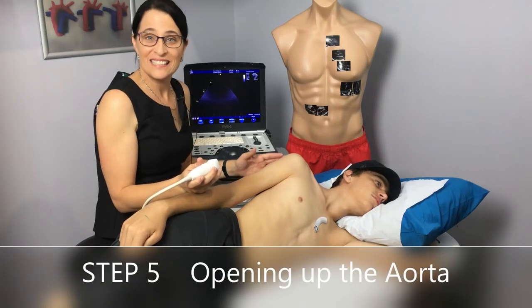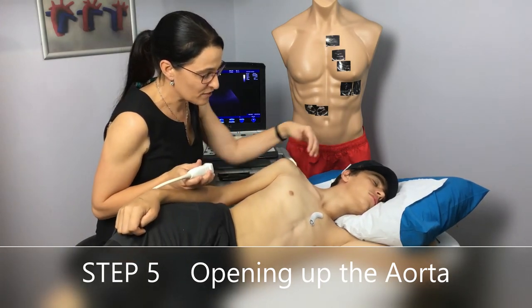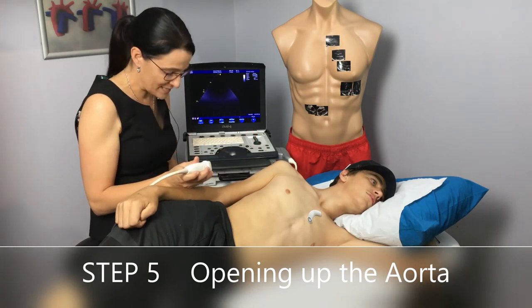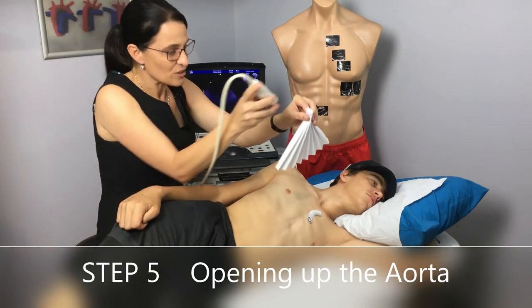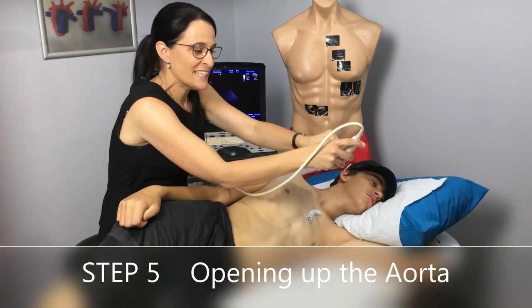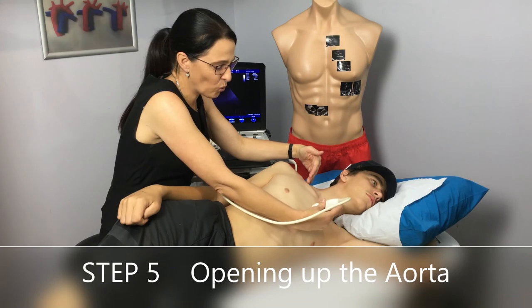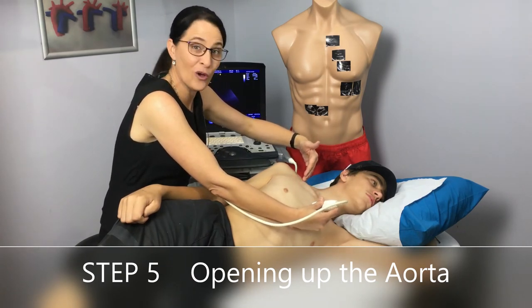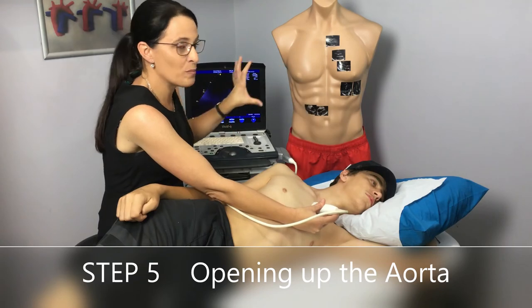Step number five — this is a little optional — is opening up the aorta. I've tattooed on my patient not only his aortic valve but also the aorta. What you really want to do for a parasternal long axis is open up the ascending aorta, looking at it in its long axis. To get a long axis of the aorta, I'll use my paper fan to show you the beam — we need to be down the long axis of the aorta. The image marker points towards the right clavicular region of the right shoulder, but that won't always direct the beam down the long axis of the aorta. With a little slow clockwise turning of the probe you can achieve a long axis of the aorta, which will inadvertently open up the LV.